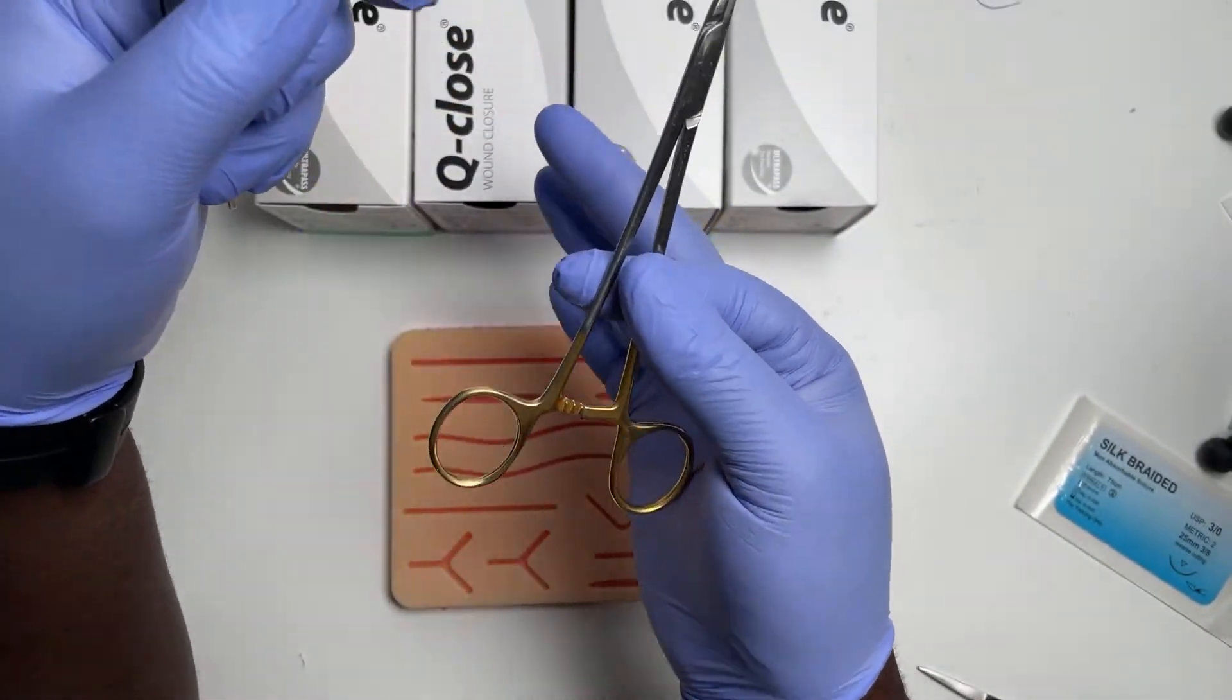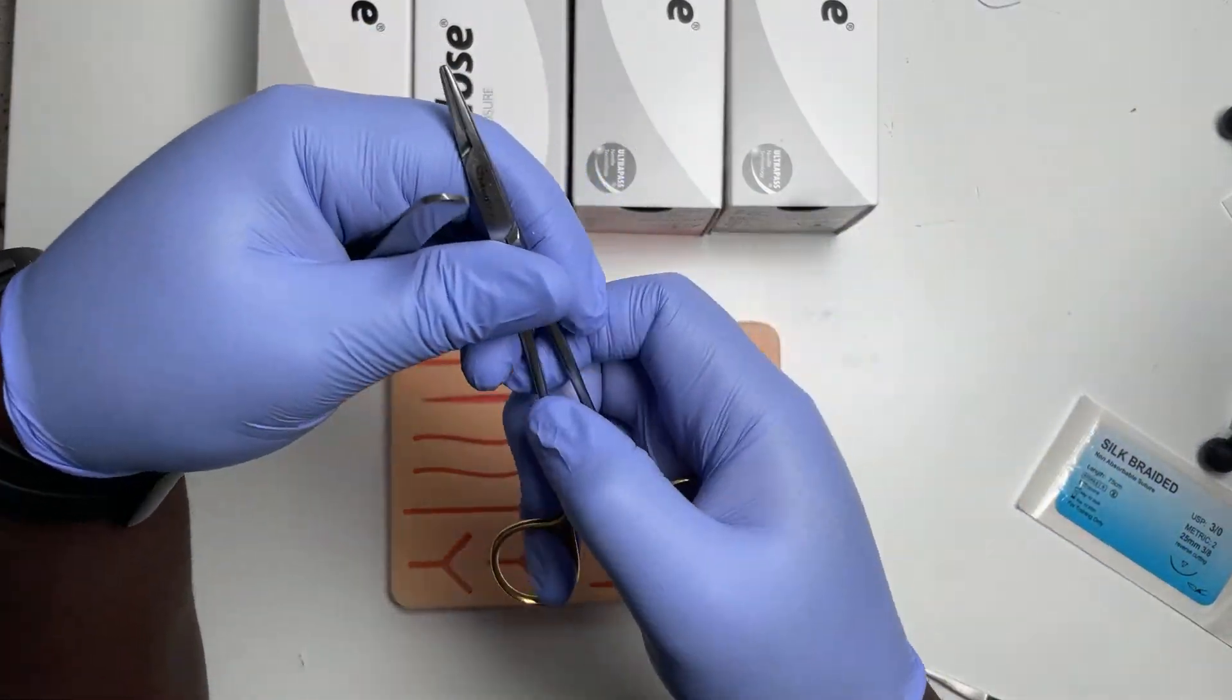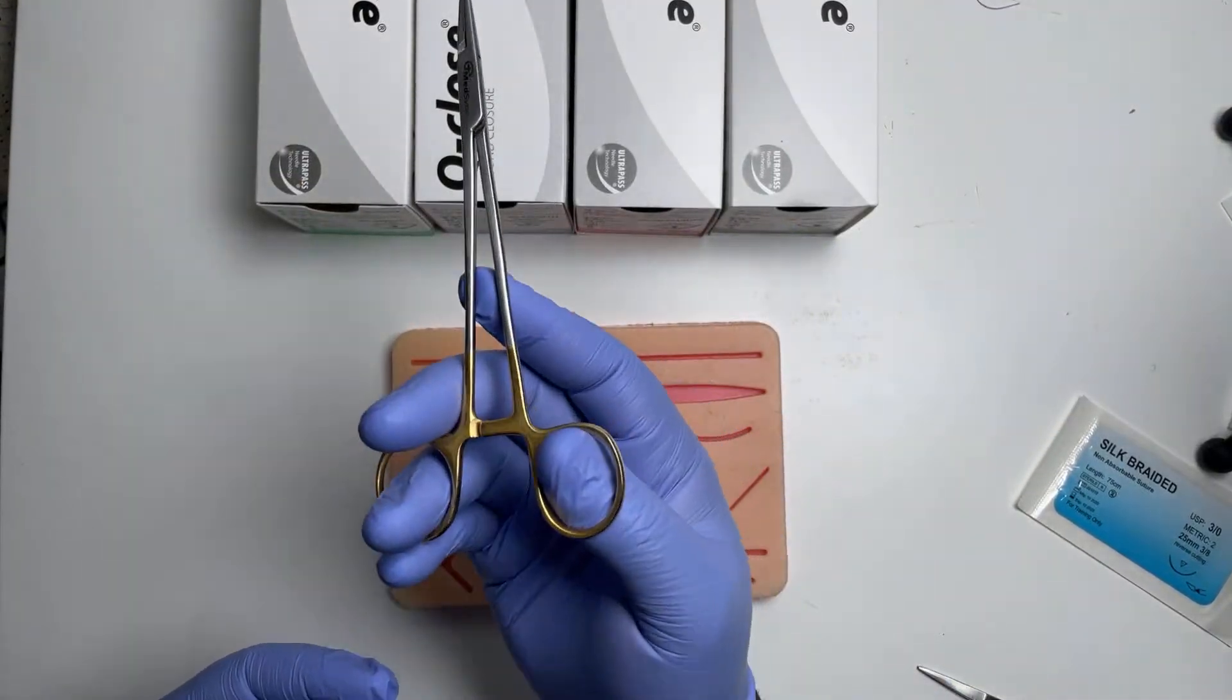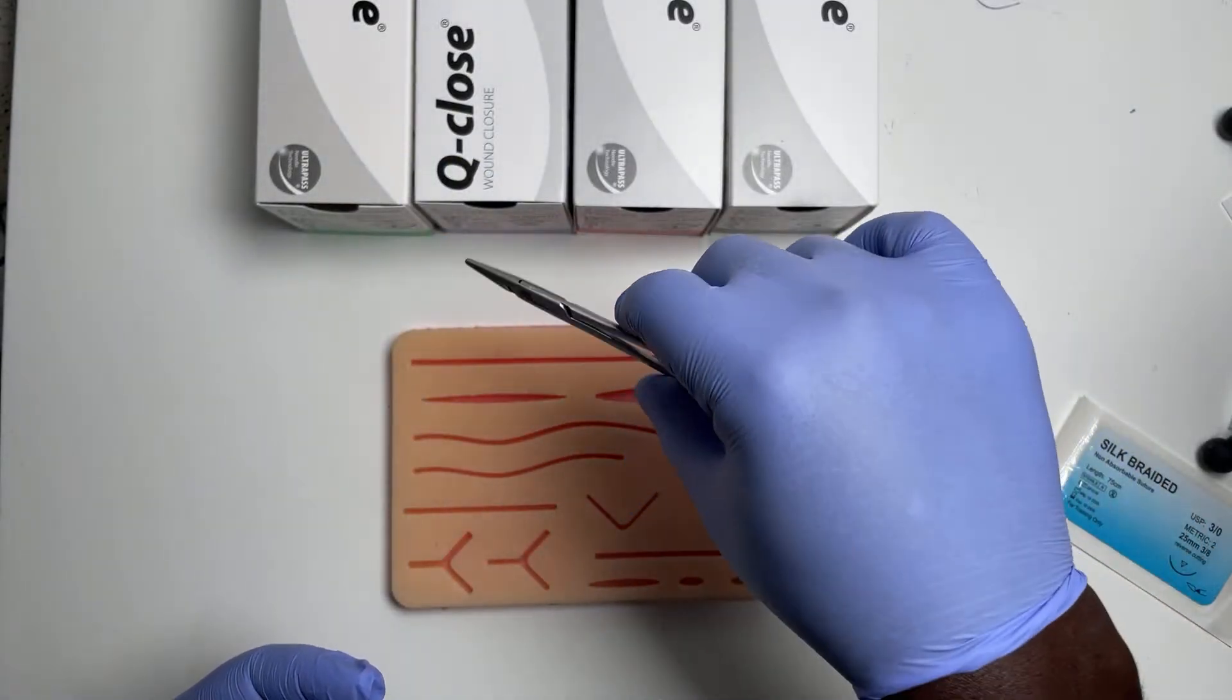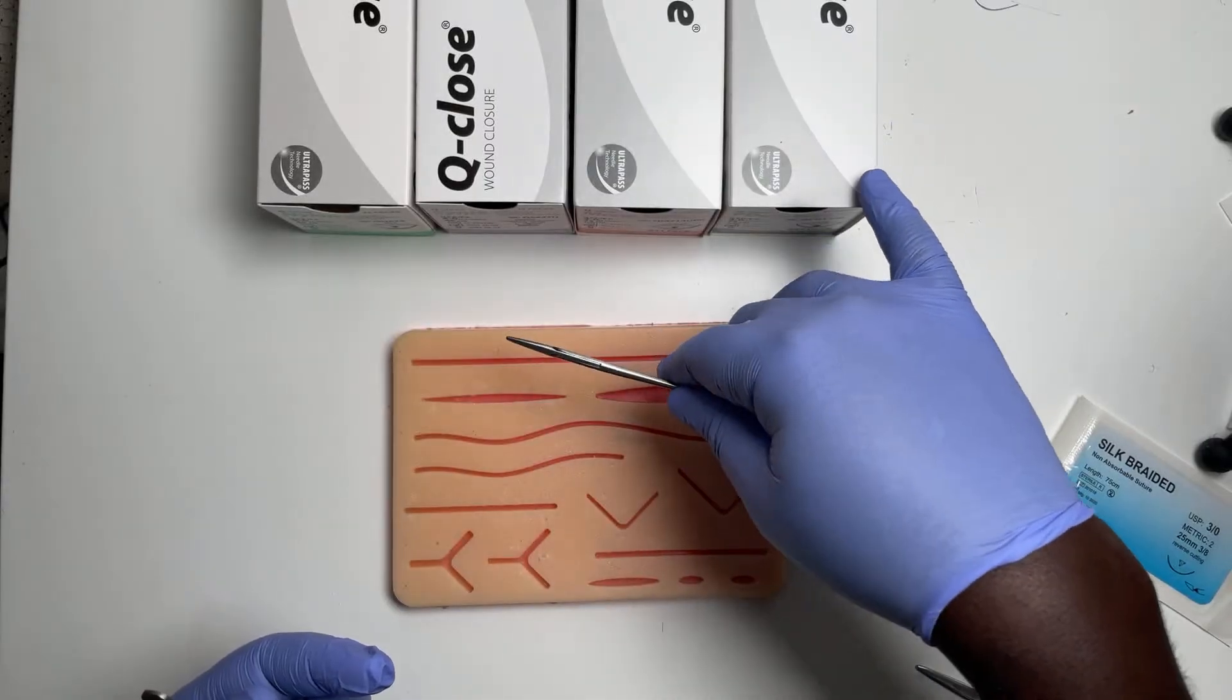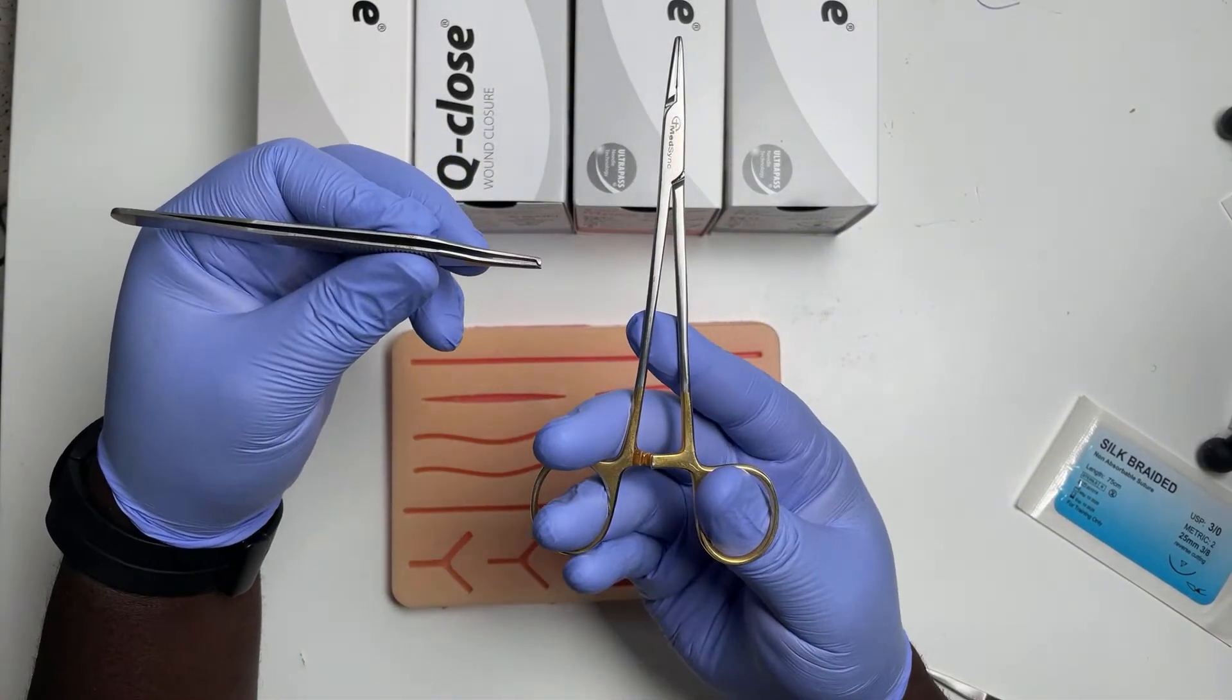The other way of palming it is like this. I tend to do that if I'm doing backhand. If your wrist rotates really nicely, then that's good for you. My wrist doesn't really supinate or turn backwards too far. So to get more range of movement, I can twist the needle holder with the needle in it and start however I want. It's just an extension of your fingers.